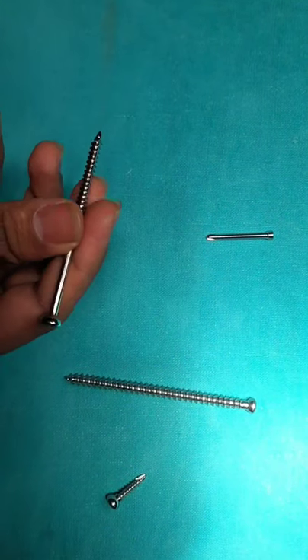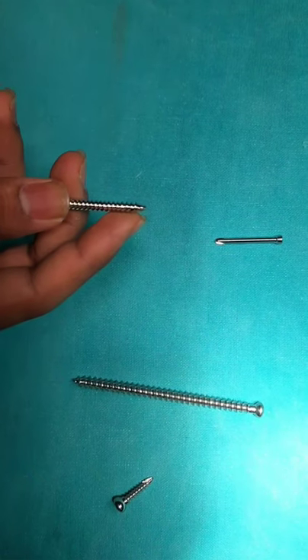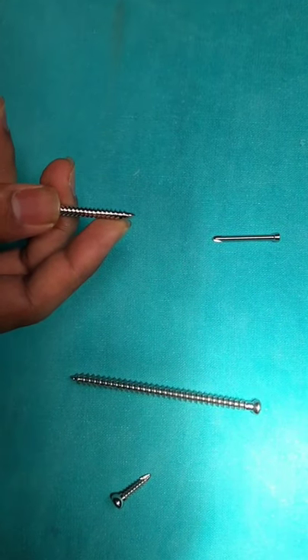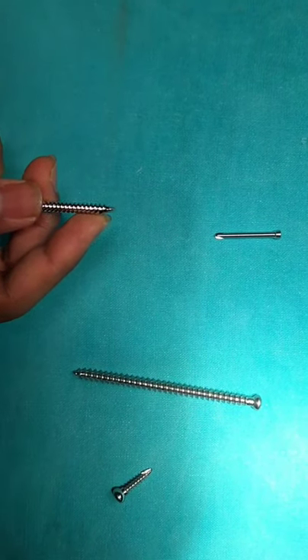Malleolar screws are a type of trocar screw. The trocar tip is suited for the soft cancellous bone of the distal tibia. Syndesmotic pins and locking bolts used in intramedullary nails are types of trocar tip.